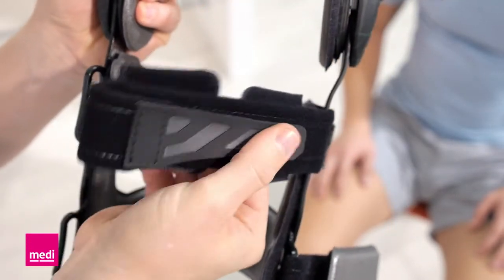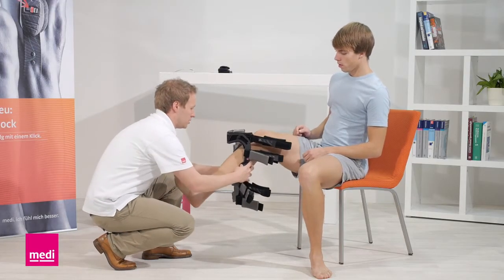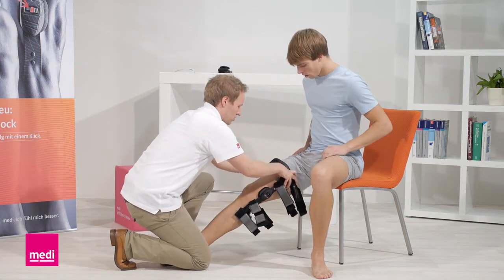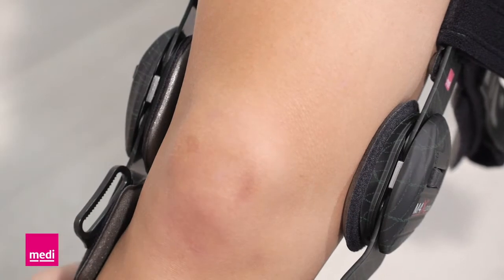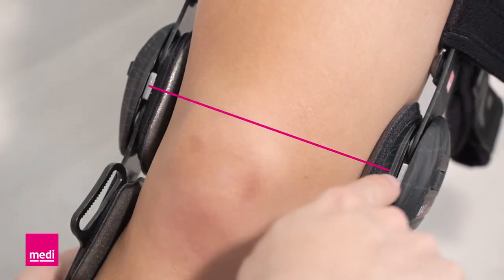Make sure that all the straps are open. To prevent incorrect fastening of the Velcro straps, it's recommended to close them again afterwards. Pull the orthosis up over the straightened leg. Position the orthosis so that the middle of the hinges are at the level of the superior border of the kneecap. Make sure that the orthosis is not twisted on the leg.